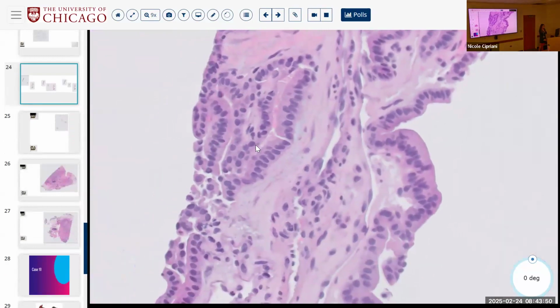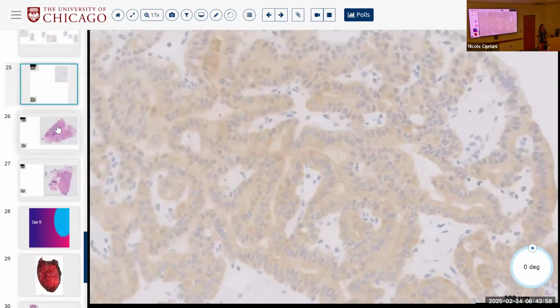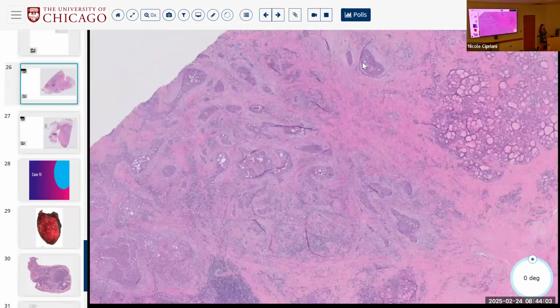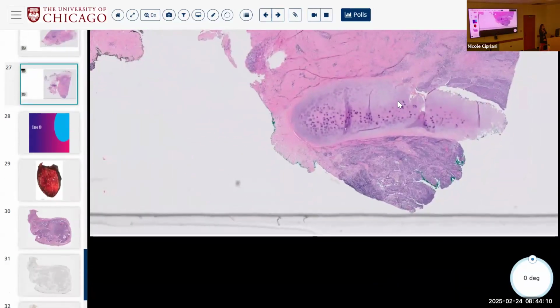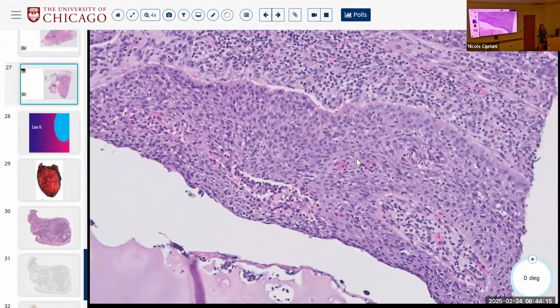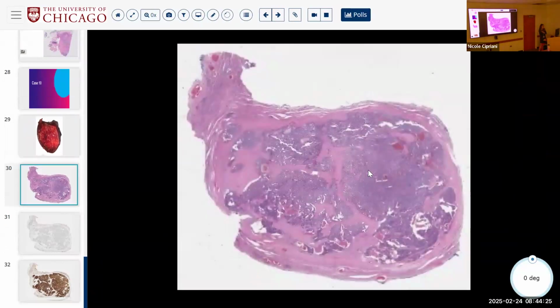So look at these, but you'll convince yourself that this is a conventional papillary carcinoma, which is also BRAF positive, right? So this arises from a PTC. You can see the resection specimen here that has both squamoid and papillary, conventional architecture, and you can see they had to do a partial tracheal resection. So the point here being squamous, anaplastic, BRAF. Okay. And then the very last one, which is super juicy and hemorrhagic.